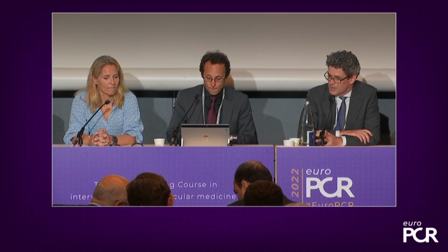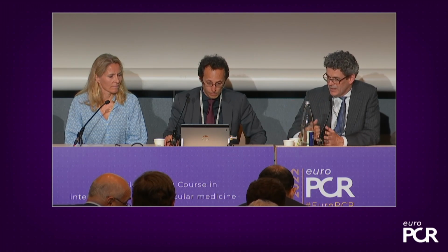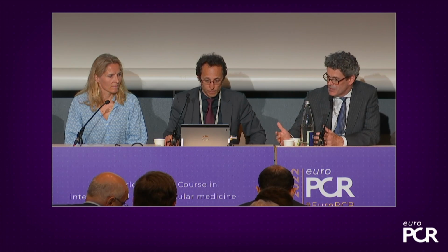I think we're seeing now, irrespective of calcium morphology, and with the data that Anja presented, that perhaps the prototypical concentric lesion which we all started with, the calcium distribution is less relevant now, because it's effective in all morphologies, not just concentric. So within a bifurcation where you've got eccentric calcification, sometimes with nodules protruding, IVL is becoming the universal modality. That's certainly my experience.